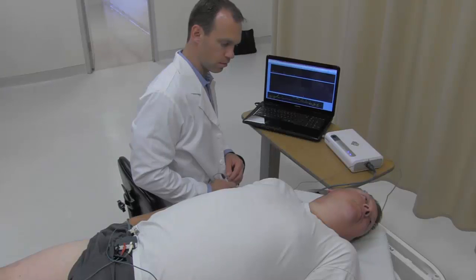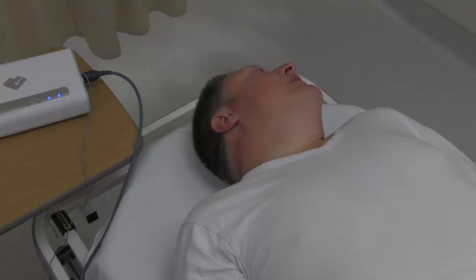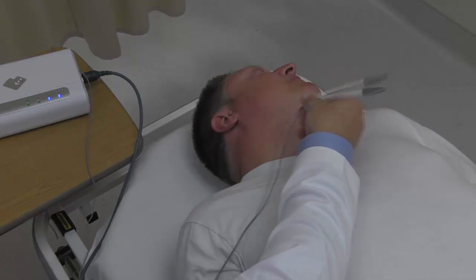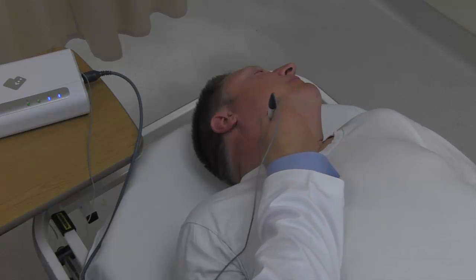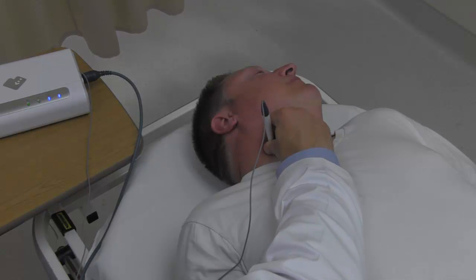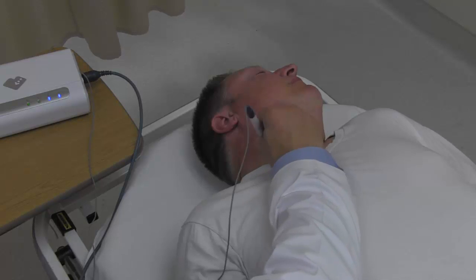While sitting at the side of the exam table, place the tonometer on the patient's carotid pulse, visually connecting the sensor at the tip of the tonometer with the mark made earlier on the patient's neck. The operator's finger should then be positioned at the base of the tonometer in contact with the patient's skin. This provides maximum stability while allowing for the optimal control needed to make the fine, slight adjustments necessary to acquire a high-quality signal. It is also important that the operator comfortably rest his arm on the patient's shoulder, chest, or other firm surface to minimize any variation in hold-down pressure.